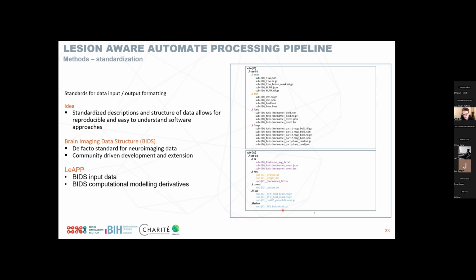So we computed, I think I mentioned this before, these lesion load metrics that for each region of interest give us a value between 0 and 100%, basically saying how many voxels of that region are actually part of the lesion itself, to give us some information about the lesion that we then want to use to model in TVB, for example.